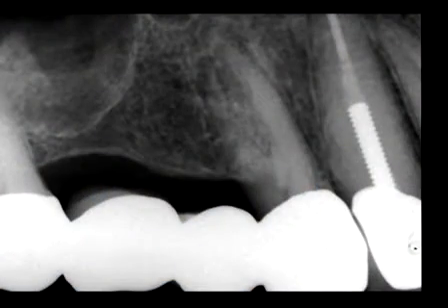This is a preoperative film of the anterior abutment. Notice that this tooth appears to have 3 distinctive roots. Notice the pulp chamber is very small, and you can just barely observe it just below the margin of the crown. Using the principles we've previously talked about, let's take the bridge off so we'll get closer to the pulp chamber and have a better orientation to the underlying roots.